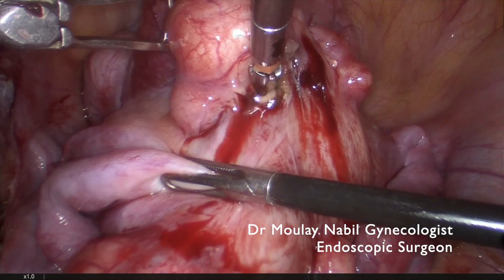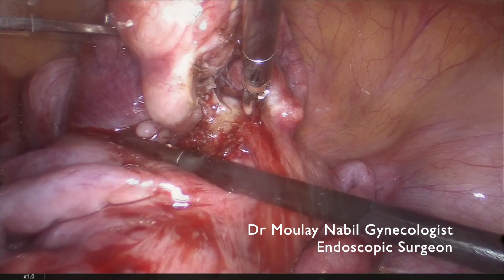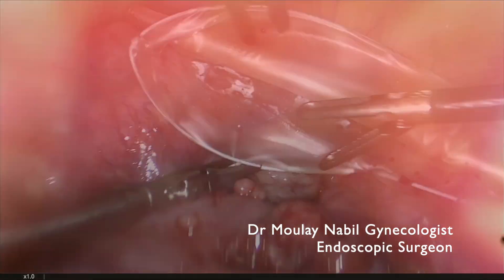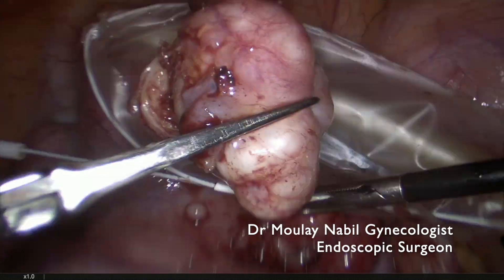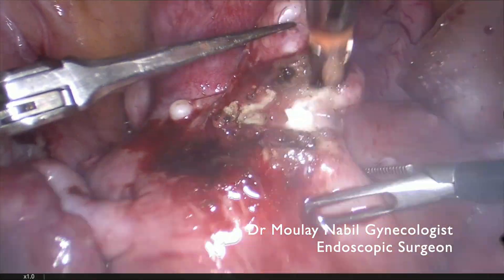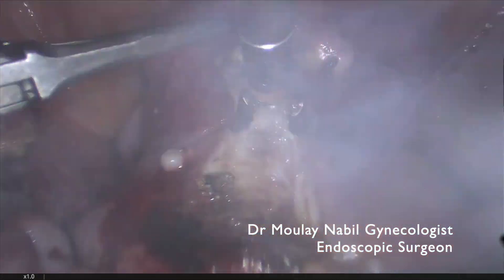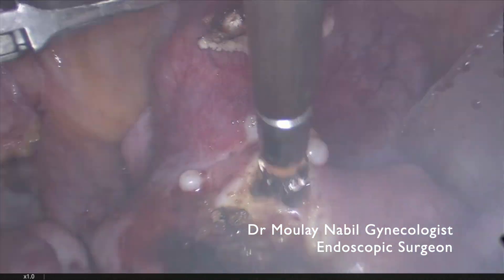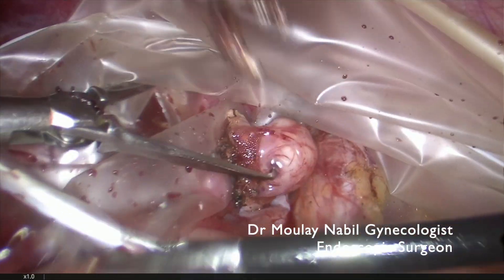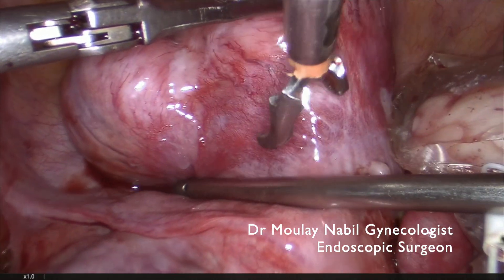This patient had an MRI before surgery to see exactly the myoma positions. In cases of polymyomectomy we use an endobag, which allows us to place every removed myoma inside it immediately, preventing free myoma fragments inside the abdominal cavity — particularly important for small myomas.